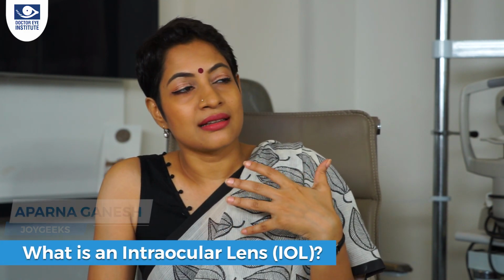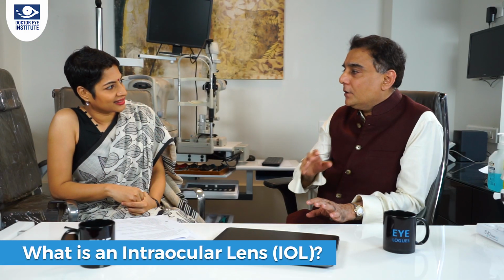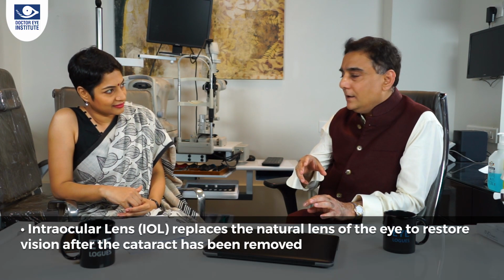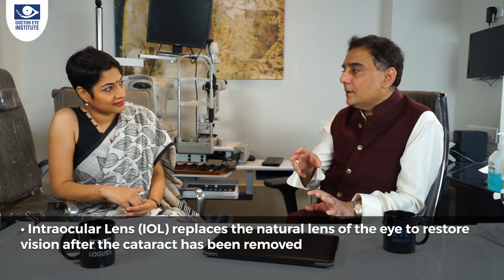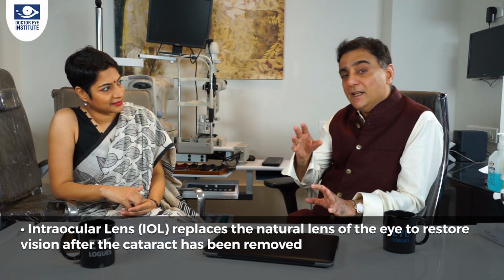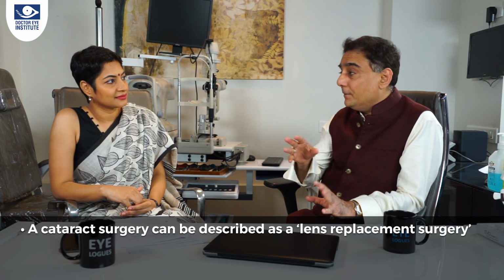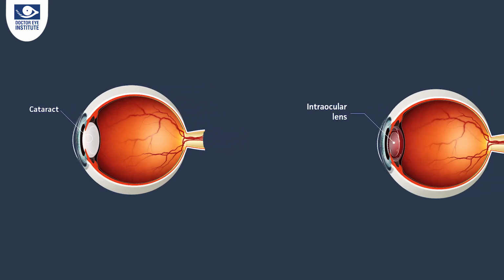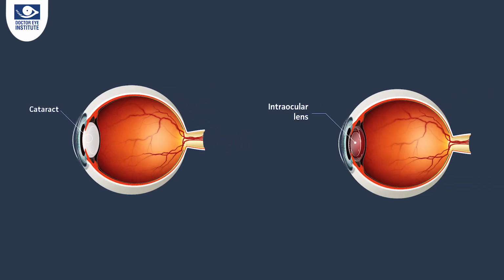We commonly hear the term IOL, which is intraocular lens. Doctor, can you please help us understand a little more about that? Intraocular lens is a lens that we place inside the eye in the same location where the cataract was removed from. Okay. So essentially, it's like a knee replacement. It's a lens replacement surgery. Okay. So you remove the lens, leave the support that's necessary, and put a lens inside the eye. And that's actually necessary to be able to see well.